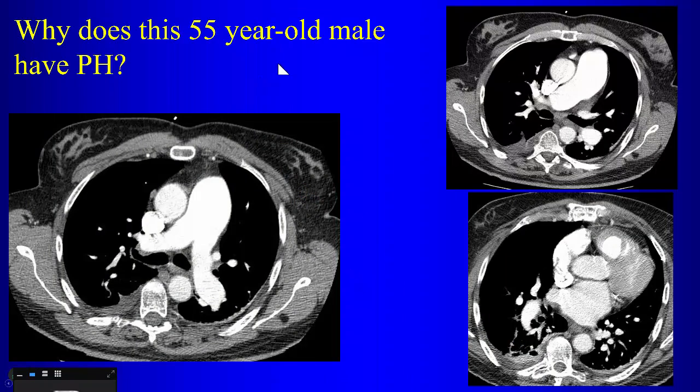So here's a man with pulmonary hypertension, big pulmonary artery. Any thoughts about this case? Obstructive sleep apnea. Well, that's certainly a consideration. So you're thinking about that because you think the patient might be... Because he has gynecomastia. Well, that's interesting, right? Why? This patient does have gynecomastia, right? So why does this patient have gynecomastia?